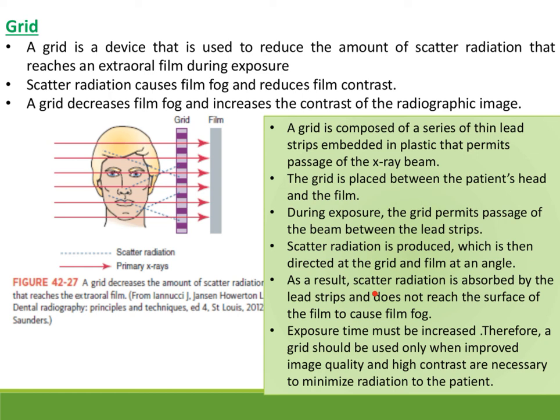Okay, so grids, you will definitely get a question in your exam. Grids always reduce the scattered radiation and increase the image clarity, but there is more exposure to the patient. Exposure time must be increased because of the use of grids, because they are removing the scattered radiation. So that is one disadvantage of the grids that we see.